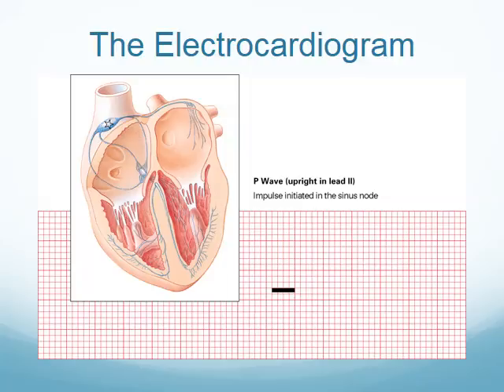Most of the time it's secondary to some type of electrolyte derangement, and the cause of the U wave is actually unknown. They really don't know what it is representing. It could be delayed repolarization of the ventricles, or just a mirror effect of the ventricular walls. Nobody really knows what the U wave is, and what it usually looks like is just a small wave, smaller than the T wave, seen in the same direction as the T wave.